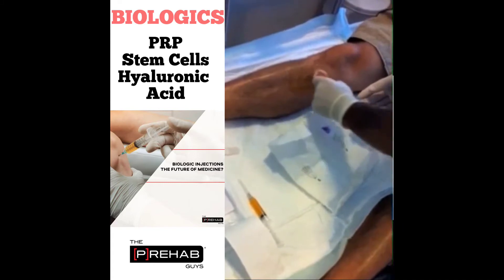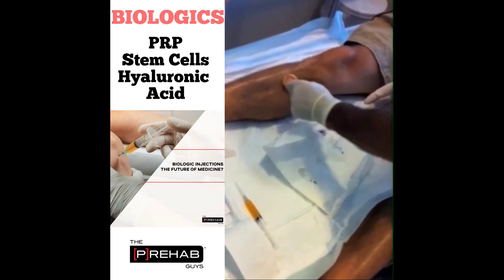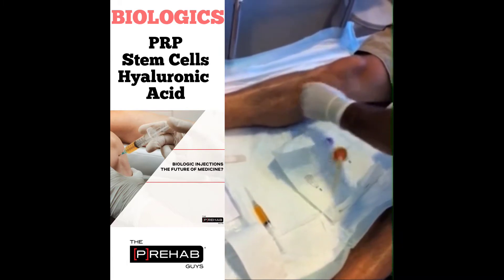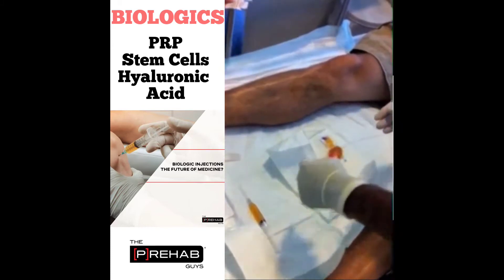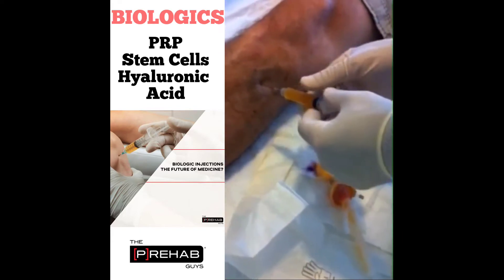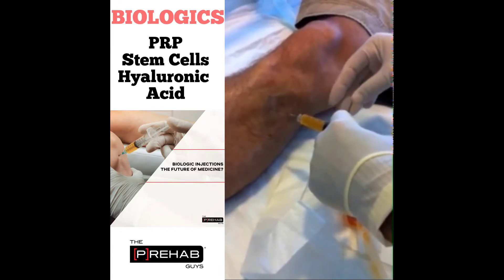This addresses the specific pathology. In this instance, we're dealing with pathology that is adjacent to the bone and is easily palpable. The area and defect is prepared utilizing chlorhexidine scrub or betadine, followed by alcohol swabs. The PRP is injected after again palpating the area of maximal tenderness.